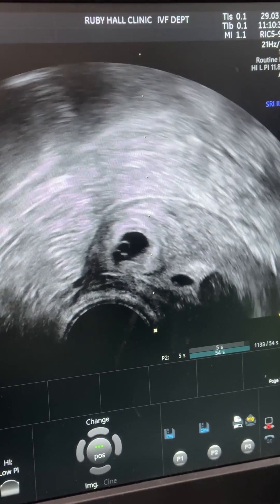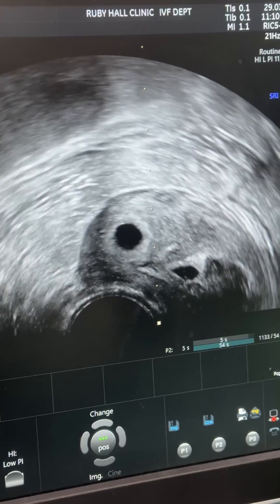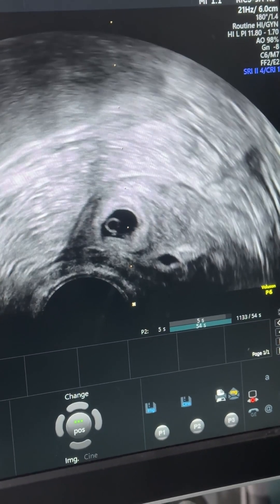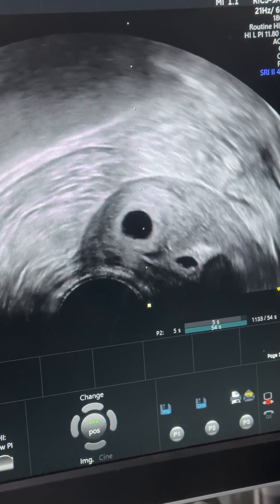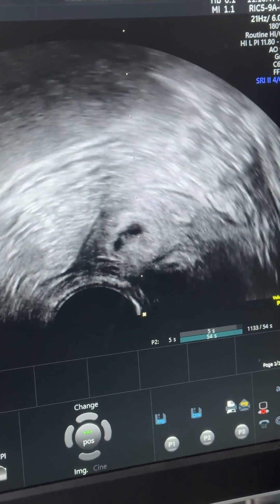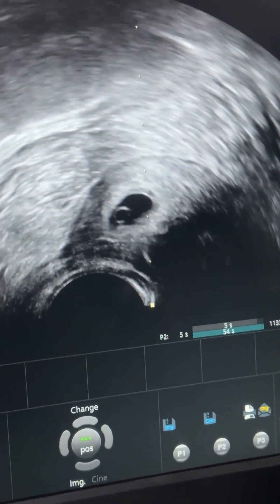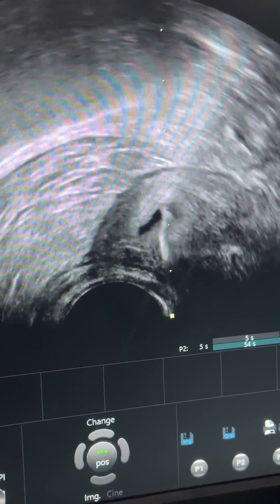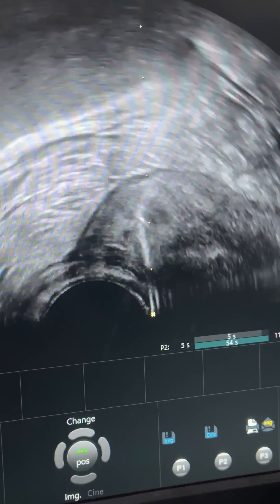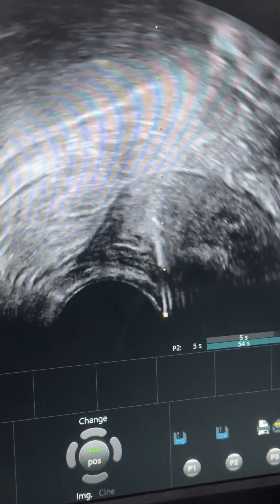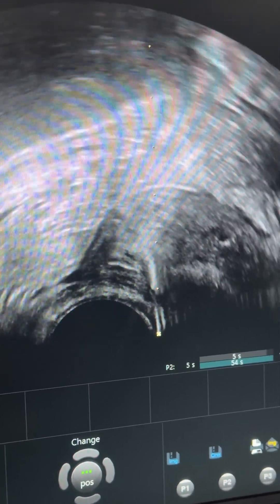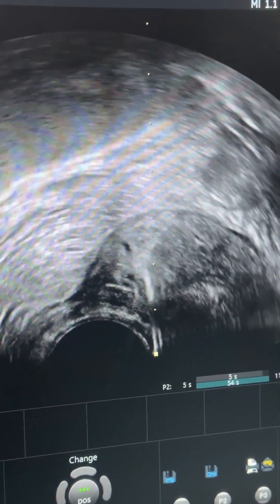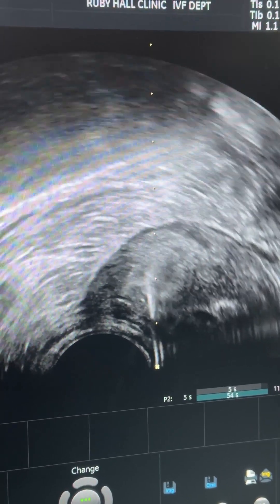I am trying to suck out. The biopsy mark is taking me there already and my needle will come in. I am entering the sac, aspirating the complete yolk sac, and I will put a KCL here — that will help me.